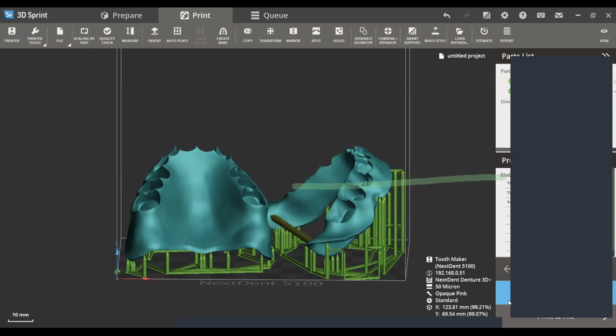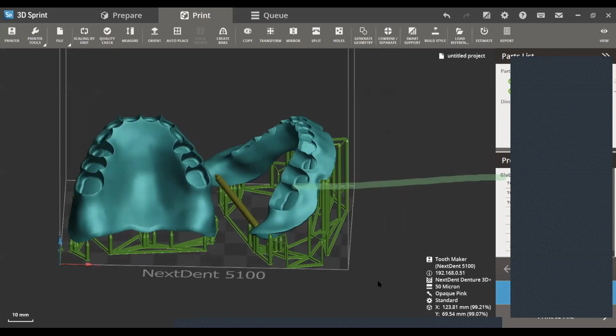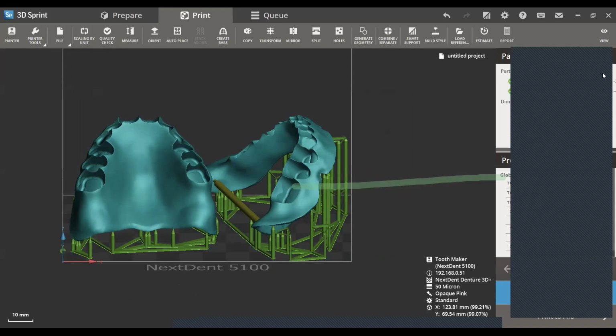I don't have my printer on right now because I'm in a little office, so I'm not going to add it to the queue because it's not connected. So thank you for joining me. I'll go into more detail about shading and things like that tomorrow and do the full shebang. I'm going to print live and assemble the teeth and clean everything.